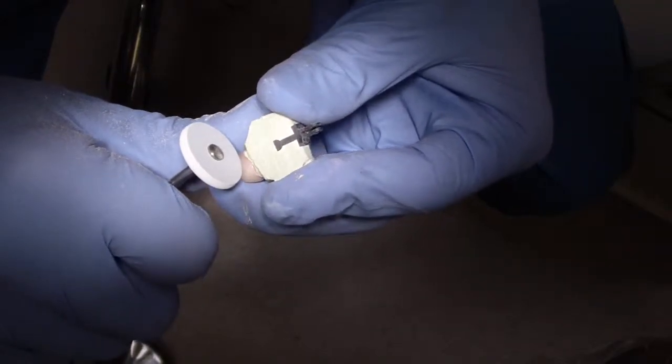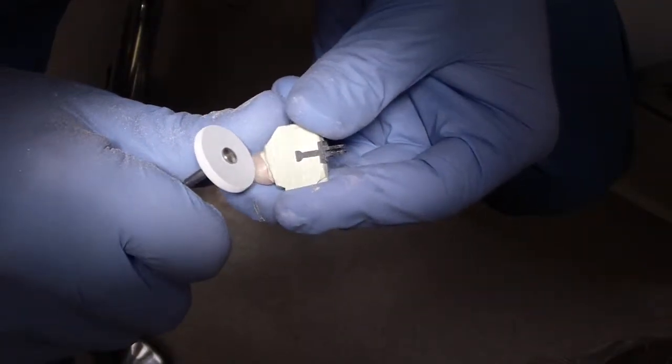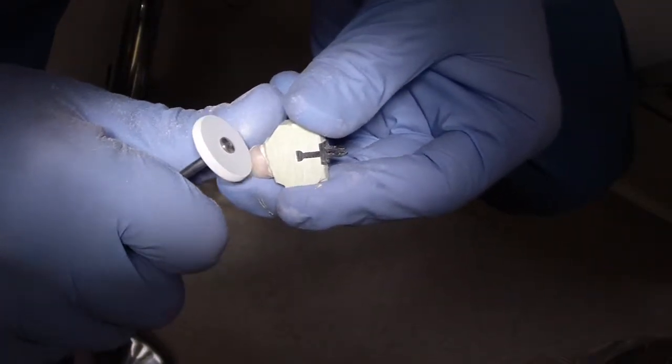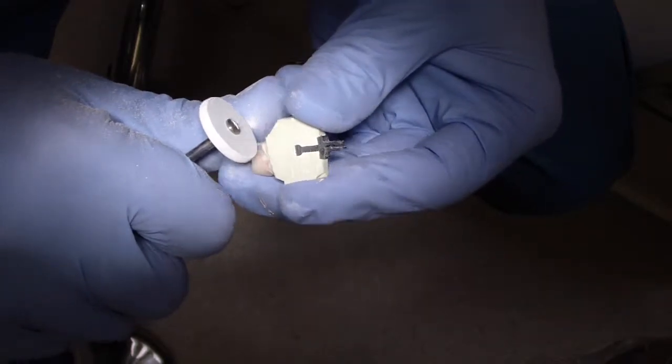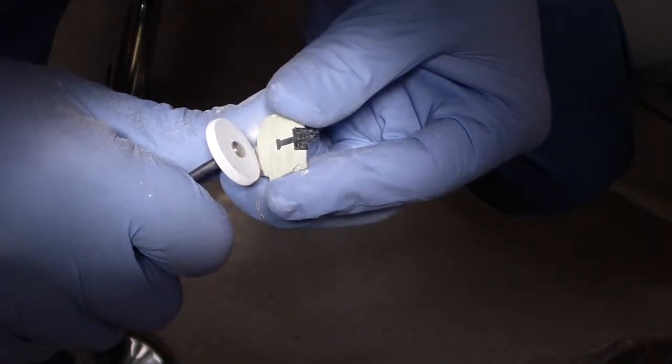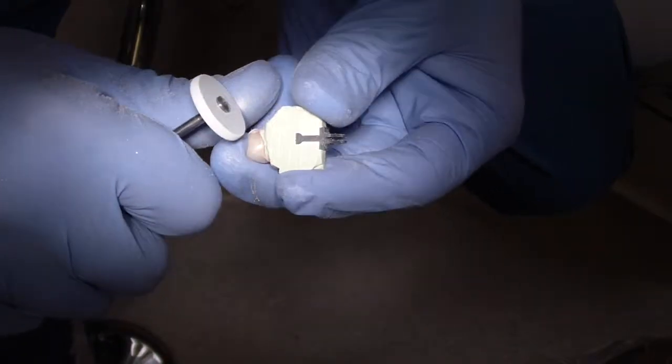I'm making sure I know where my contact area is, staying away from the contact area. I'll use this heatless wheel just to kind of get rid of the big scratches from the diamond that I was using. Still a little more to go with that.